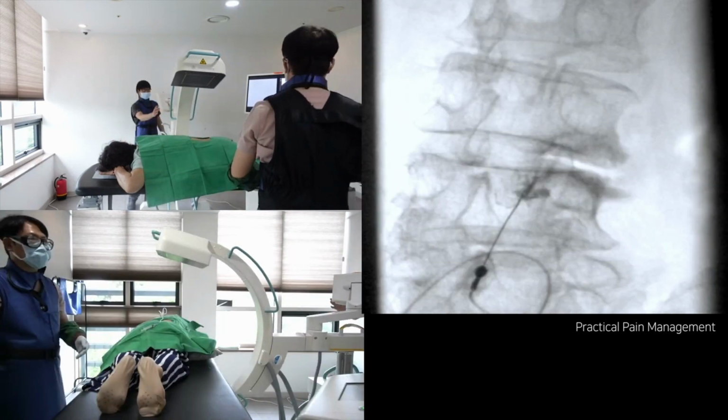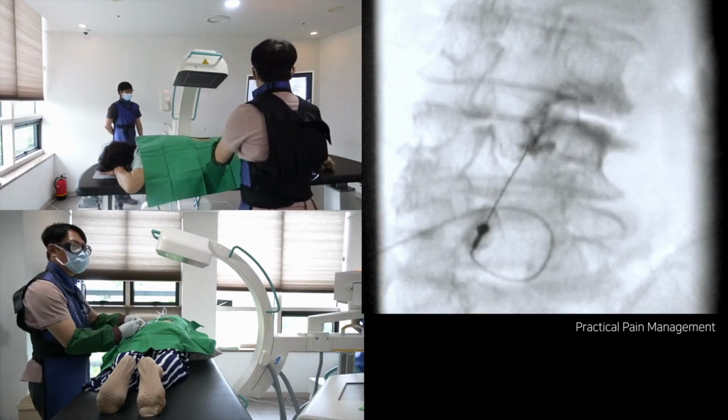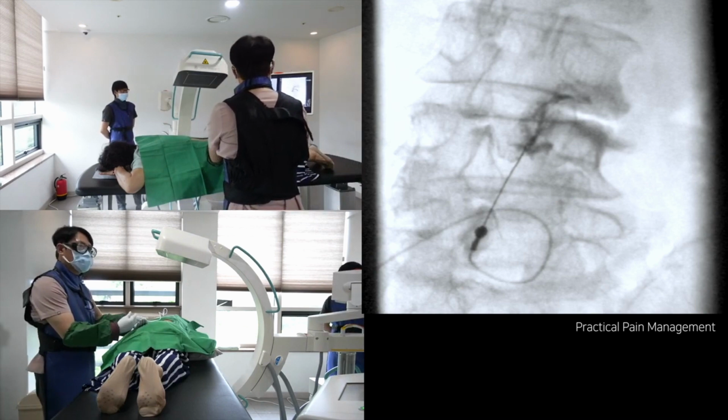I'll show an ipsilateral oblique image with the infiltrating contrast media. If the joint capsule is intact, you'll feel resistance in your syringe after injecting 1 cc of medicine. Ignoring this resistance during fluid delivery can cause nerve root compressive pain in the patient.